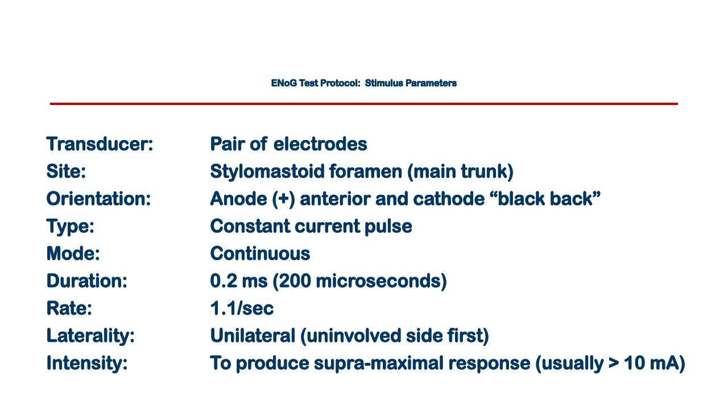And the reason the continuous is preferred is because a person does habituate to that stimulation. In other words, the more you stimulate, the more they don't notice it. They get kind of used to it. And if you constantly were turning the stimulus on and off, thinking you're being a nice person and not presenting the stimulus when you don't have to, it actually is worse for the person because it jolts them. They're not getting used to it. So it's better just to let it go as long as you're stimulating them.